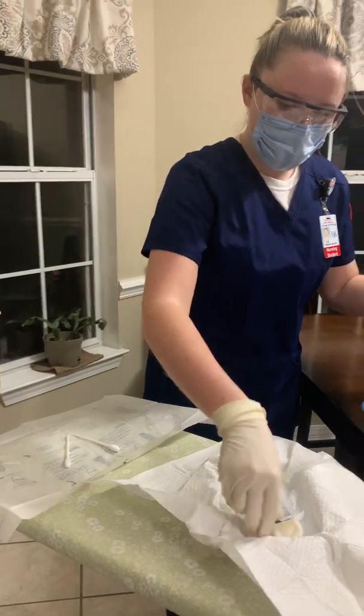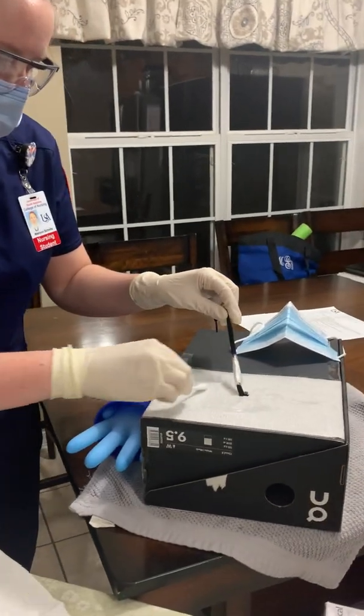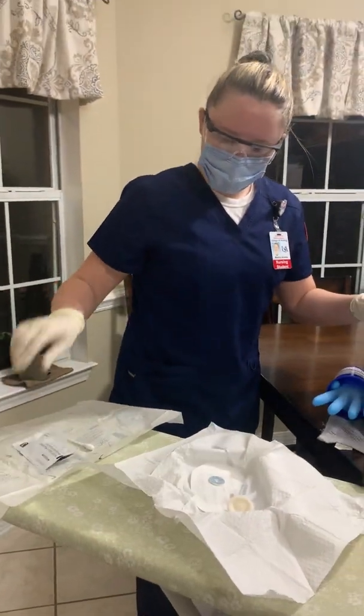Throwing this away, I'm using my glove container as my trash can. And now I'm cleansing one more time, 2 to 4 inches around, and then throwing that away as well in my package.